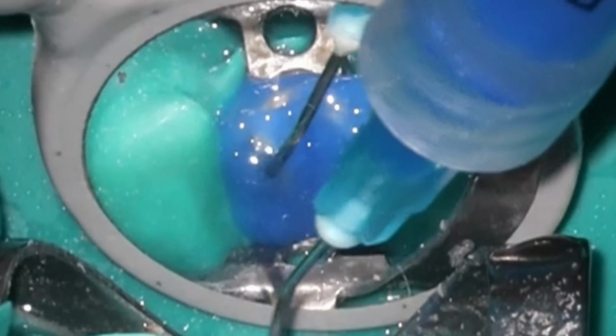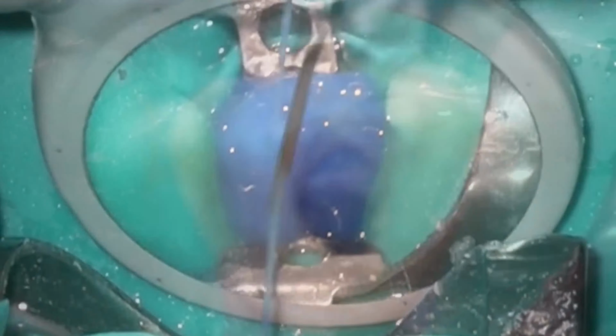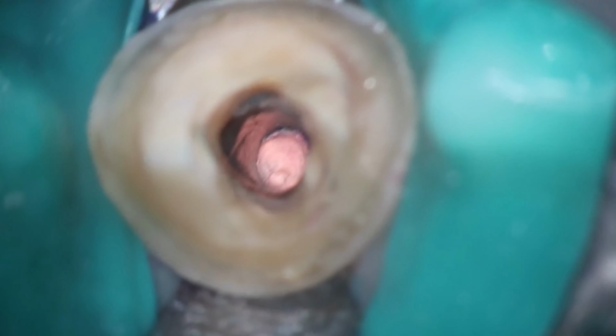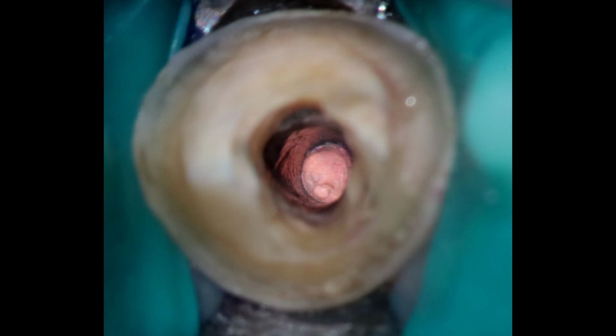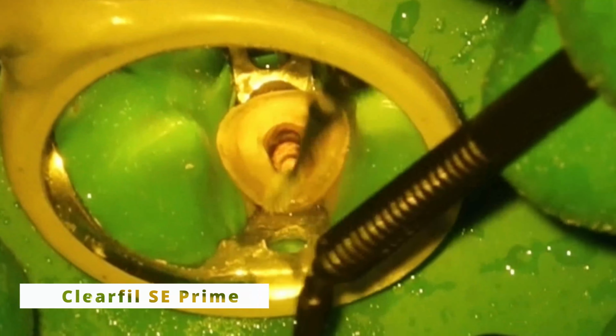And the reason why is this tooth needs a crown. There's no doubt about this. It just needs to look pretty enough so that it's going to look better than what he came in with. That's what it looks like when it's all nice and dry and ready to seal. Very pleased with that. And so, you know, think about that unreasonable hospitality thing.